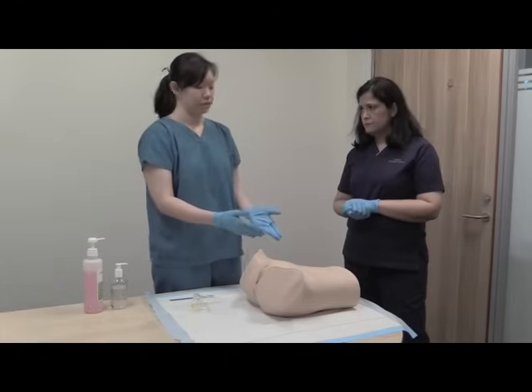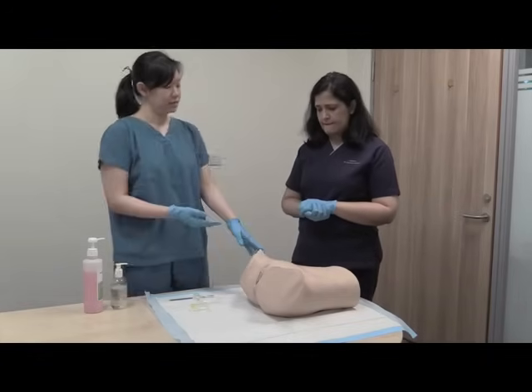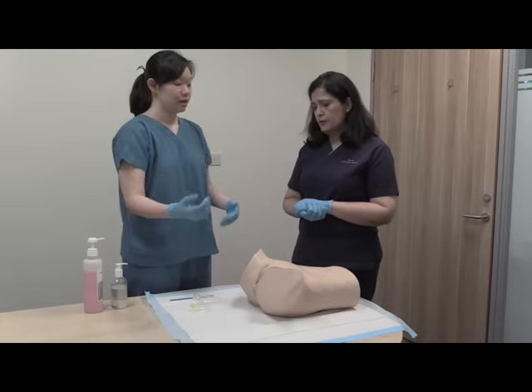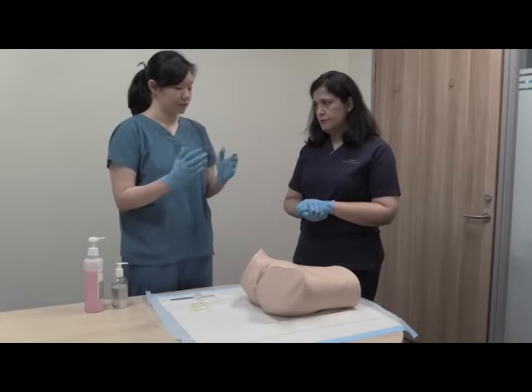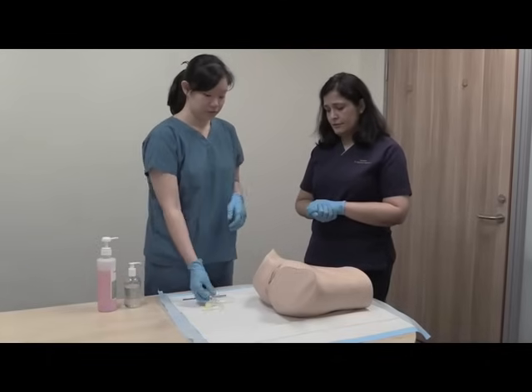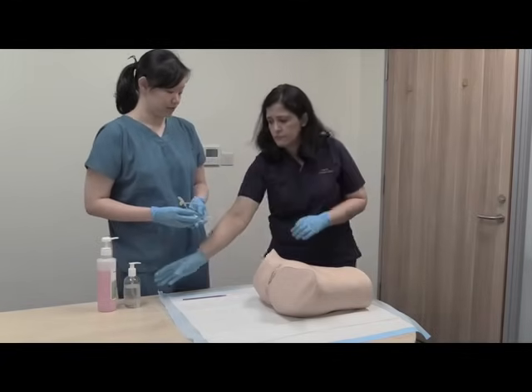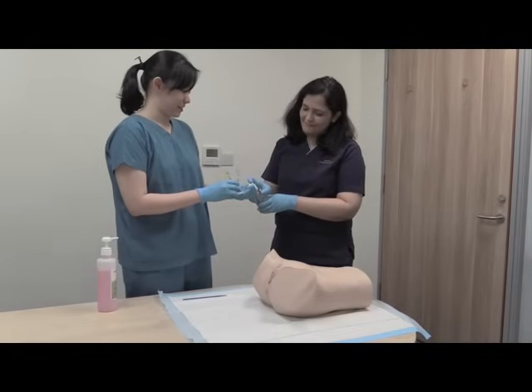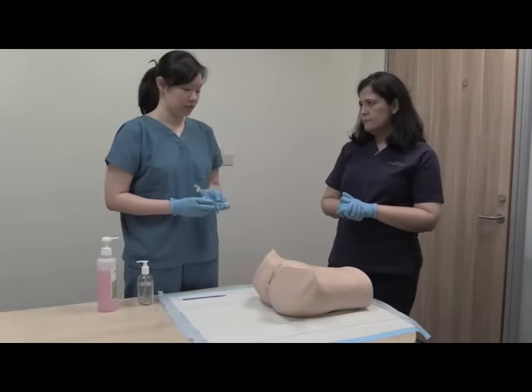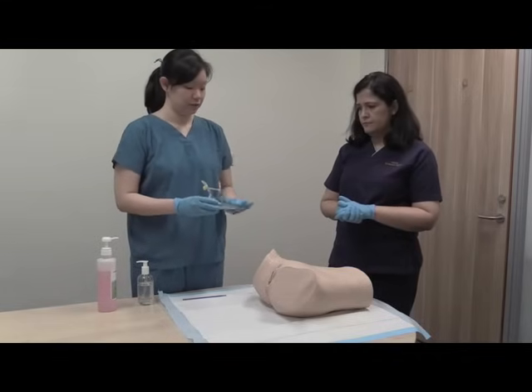When the tummy examination is done, I'll move on to the speculum examination. I'll cover the patient back and then ask Mrs. Smith to bend her knees up and open her legs to the side and relax them. Before beginning the speculum examination, I will definitely need some lubrication. I'll do a quick inspection of the vulva area to look for any obvious vulval lesions, and ensure I have a light source. I'll lubricate both sides of the speculum.